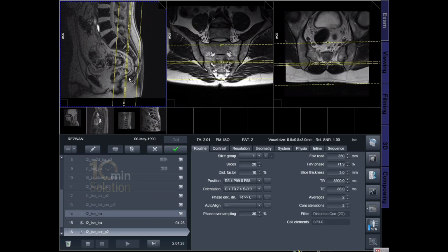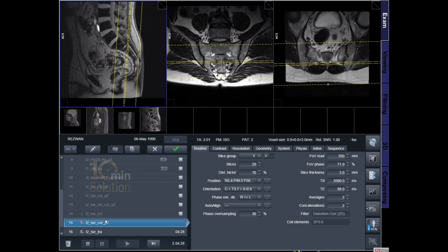Muqtadir Rahman. Today I will discuss with you a very interesting topic: how to plan an MRI of the SI joint, coronal plan. Look here, the protocol is showing here. And now I set up the planning and look at the parameters.